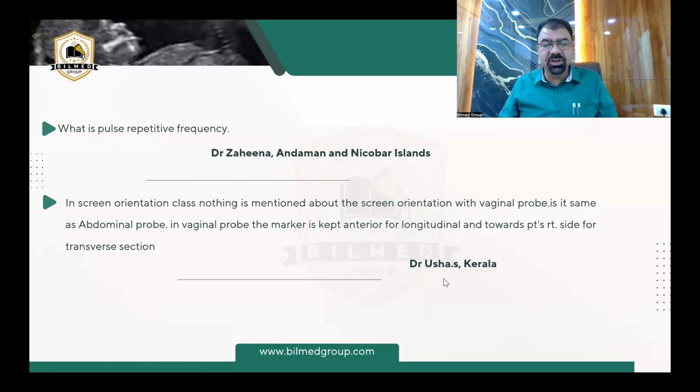In screen orientation, there are some more questions, Dr. Usha. Nothing is mentioned about the screen orientation with the transvaginal probe. Is it same as the abdominal probe? In the vaginal probe, the marker is kept anteriorly. So the basic question from Dr. Usha is whether the screen orientation is same. Now, see.